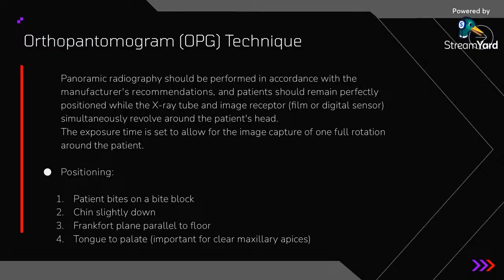So, read the manufacturer's recommendation, and the patient should remain perfectly positioned while the X-ray tube and image receptors, film or digital sensor, simultaneously revolve around the patient's head. The exposure time is set to allow for the image capture of one full rotation around the patient.